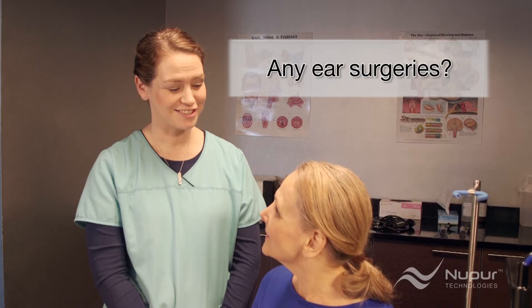One more question: have you ever had any surgeries on your ear? A yes to this question also means a referral to an ear specialist, except for ear tubes which have been removed for more than one year. If the tympanic membrane is compromised in any way, the irrigator should not be used.